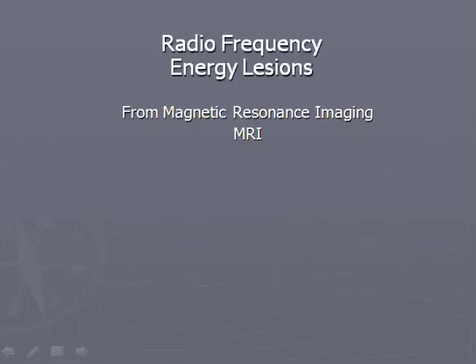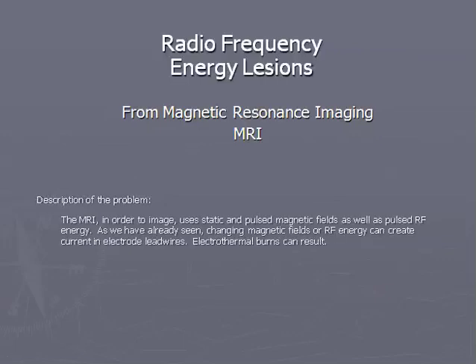Slide 12. Next, let's discuss radio frequency energy electrode lesions associated with MRI. The MRI, in order to image, uses static and pulsed magnetic fields as well as pulsed radio frequency energy at very high frequencies. As we have already seen, changing magnetic fields, or RF energy, can create current in electrode lead wires. As with the RF energy associated with the ESU, electrothermal burns can result. How do these burns occur?